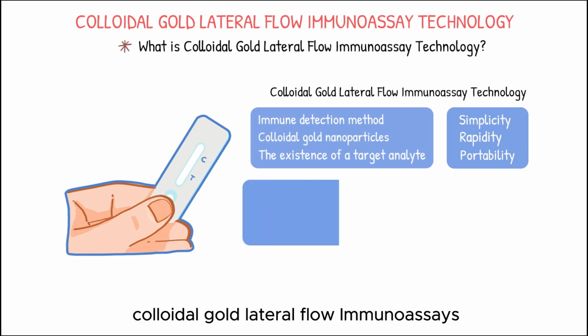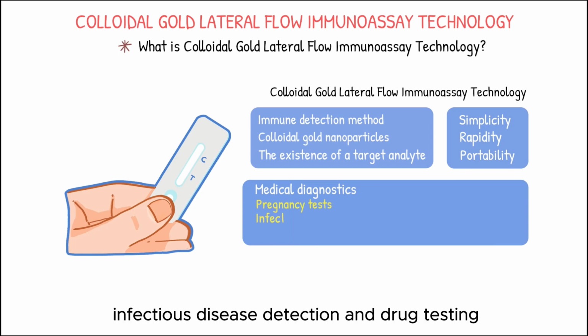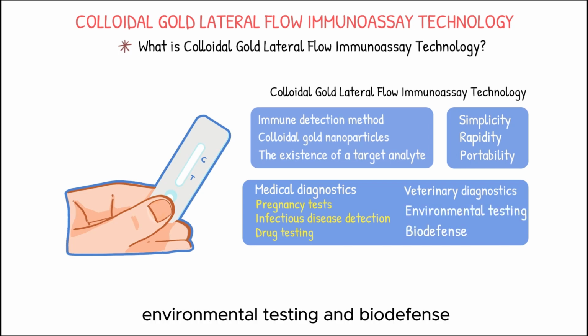Colloidal gold lateral flow immunoassays are widely used in various fields, including medical diagnostics, for example, pregnancy tests, infectious disease detection, and drug testing, veterinary diagnostics, environmental testing, and biodefense.